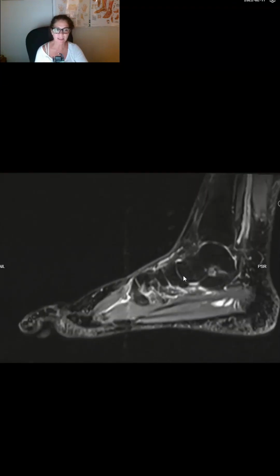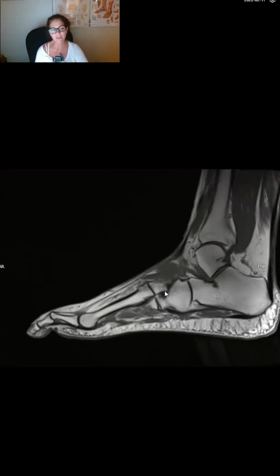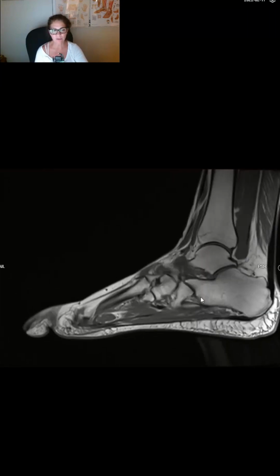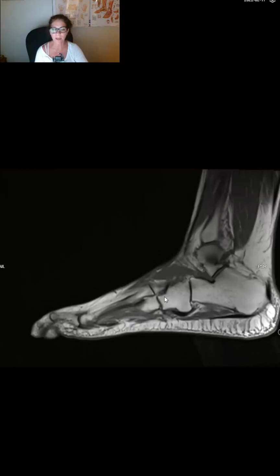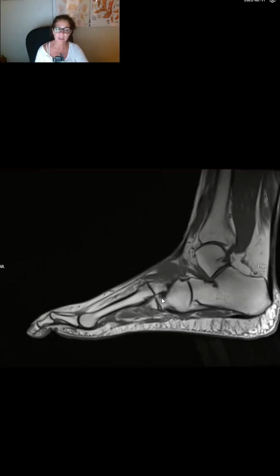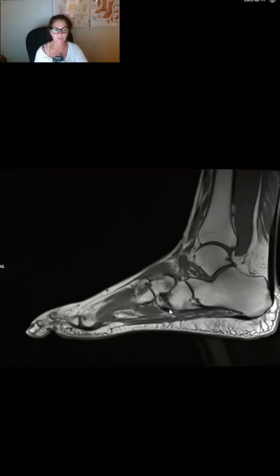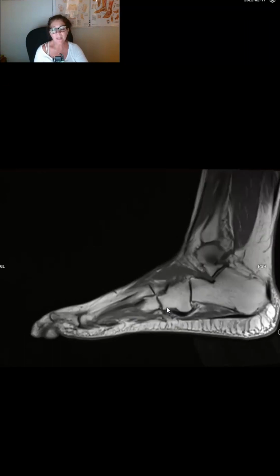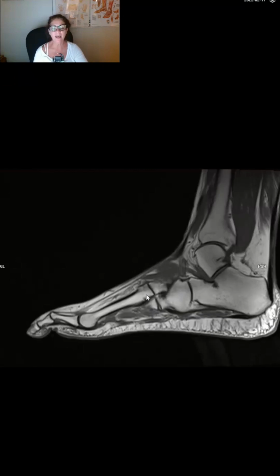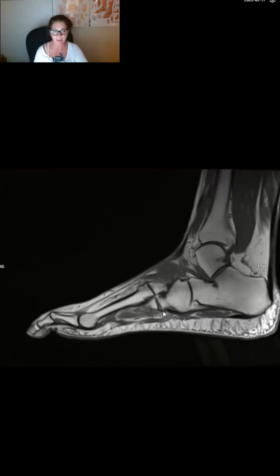So sometimes when you have pes cavus and an elevated arch, there's something that can be seen on the x-ray, something called a metatarsal stacking angle. And when the metatarsals are stacked up high, as we move from the hindfoot heel strike towards the forefoot, it can be a difficult biomechanic to smoothly roll through. And as the bones become degenerated, we can have different interligamentous sprains, or perhaps there was a marathon running or some kind of exaggerated performance sport that caused that. But even in the absence of that, when we have patients who have neuropathy, they begin to have intrinsic muscle weakness, and that can affect the gait and certainly affect your heel strike. So that would be another thing that I would be checking to see whether or not we have that.